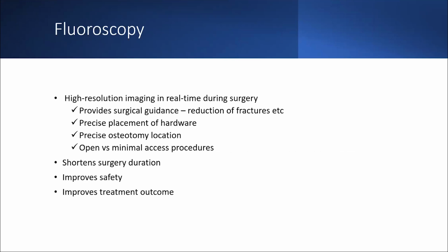So fluoroscopy allows high resolution imaging in real time during surgery, and the advantage of this is precision. You're able to locate the site of your osteotomy, place implants in the exact location where you want them, and achieve reduction of fragments or fractures appropriately.